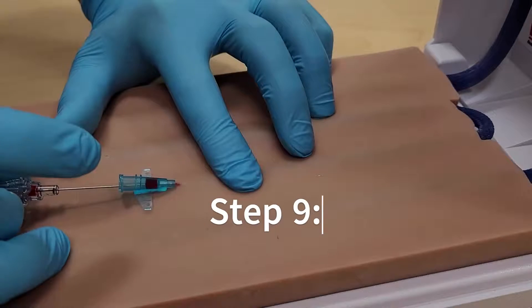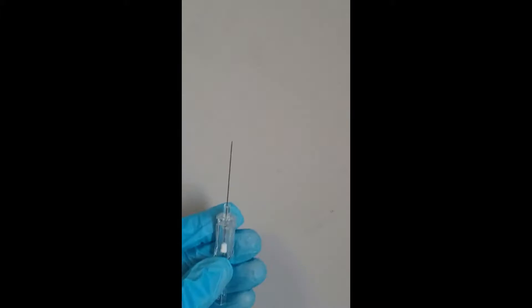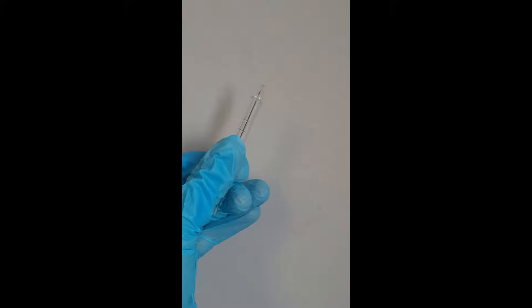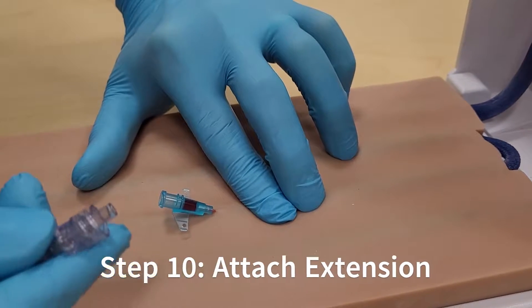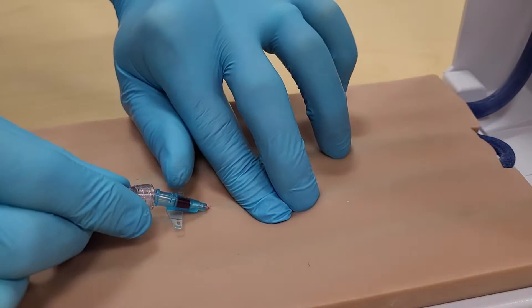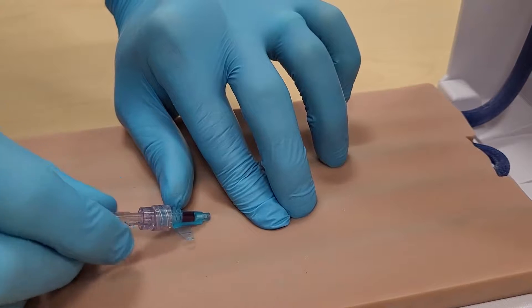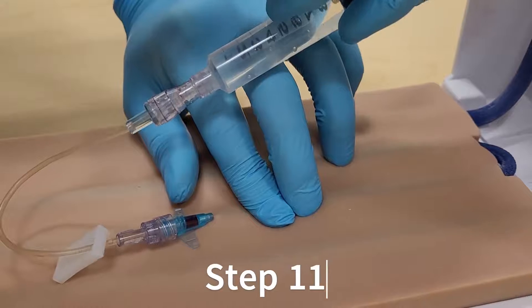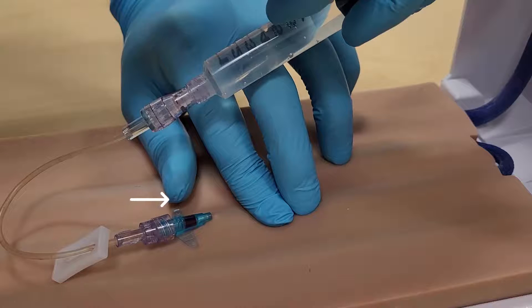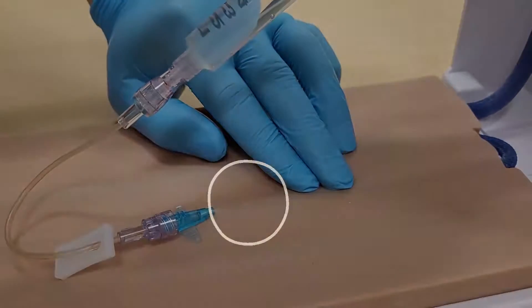Step 9. When you are ready to connect the flush, that is when you remove the needle. Use the safety apparatus to conceal the needle tip and take note of where you place it, as you will need to dispose of this safely after the procedure is done. Step 10. With your non-dominant hand still occluding the catheter, take your 10cc syringe and extension tubing and attach it to the catheter. Step 11. Flush some of the isotonic saline to check for patency of the catheter. The ability to easily flush saline through the catheter with no swelling at the insertion site confirms IV placement.